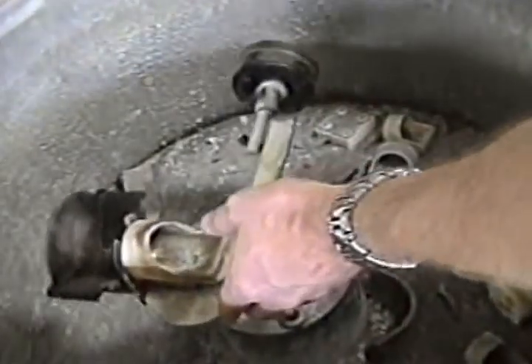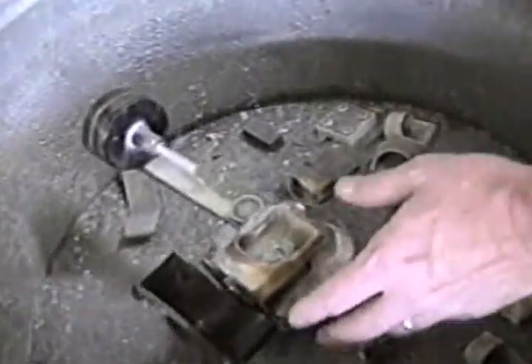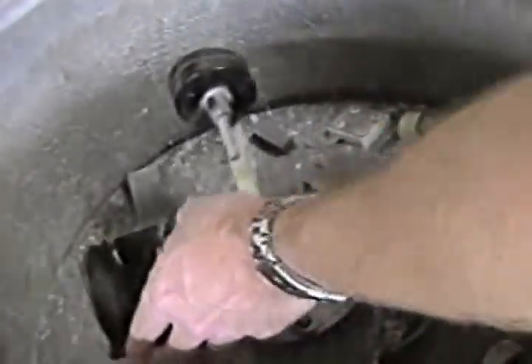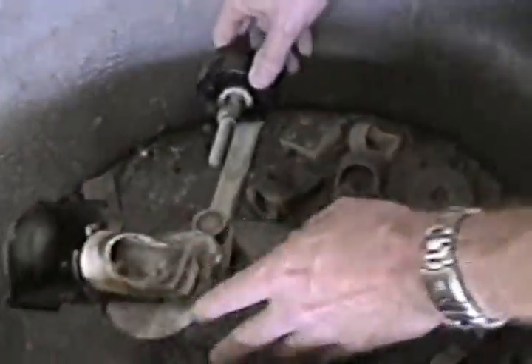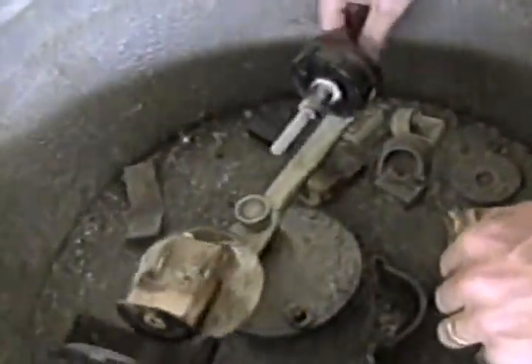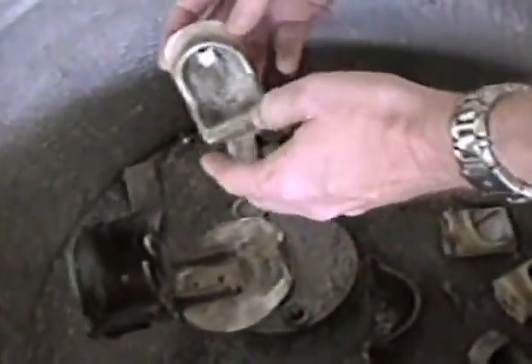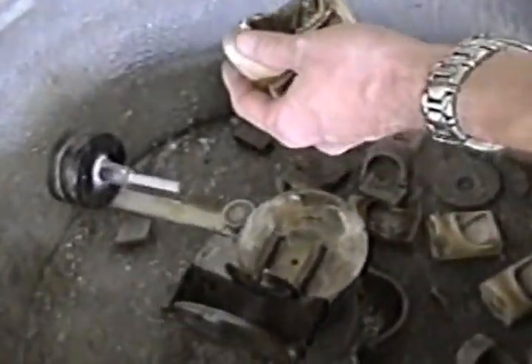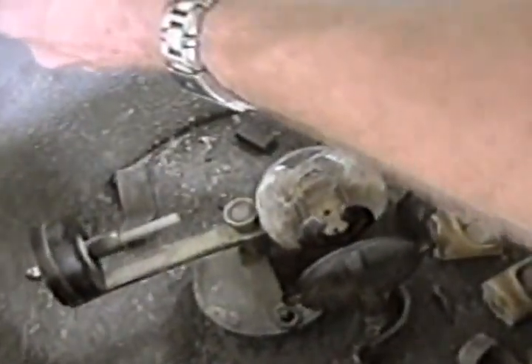My burnout oven is about 3 foot away to my right, so I'll be reaching in there with my tongs and get my ring, and I will place it in my casting machine, my cradle here, and release it. And this will be a centrifugal casting. So what I'll do to prepare for this is to clean my crucible out here, or I'll get another crucible that I use for my gold castings and clean that out just a little bit.